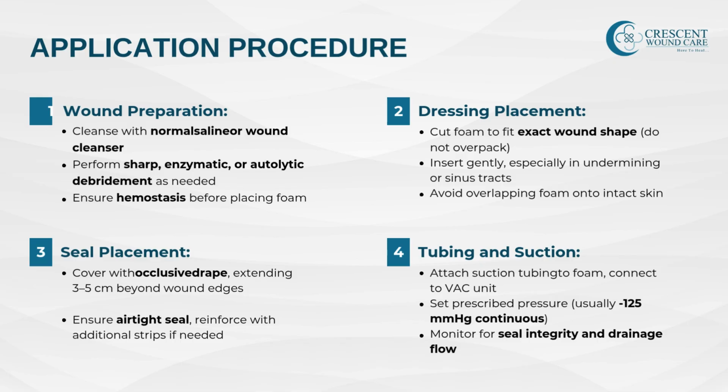2. Apply foam or gauze. Cut the foam to fit the wound dimensions snugly, but without compressing the tissue. Avoid overpacking, as this may impair healing. 3. Secure with occlusive drape. Cover the entire foam and surrounding healthy skin with the adhesive drape, ensuring an airtight seal to maintain negative pressure.